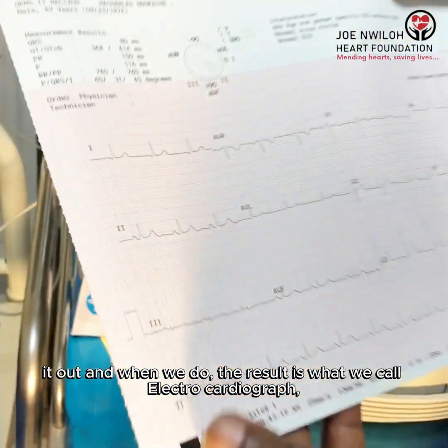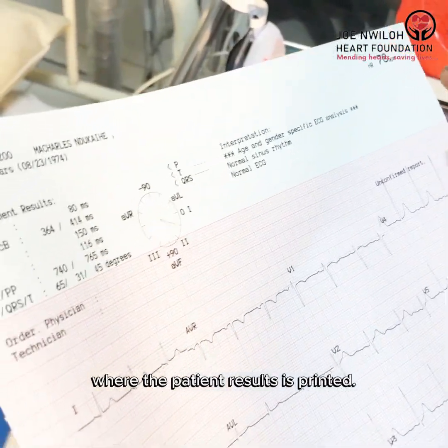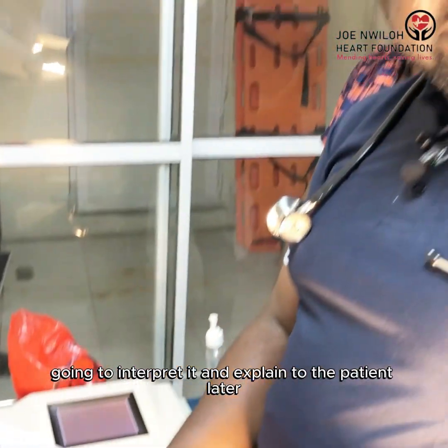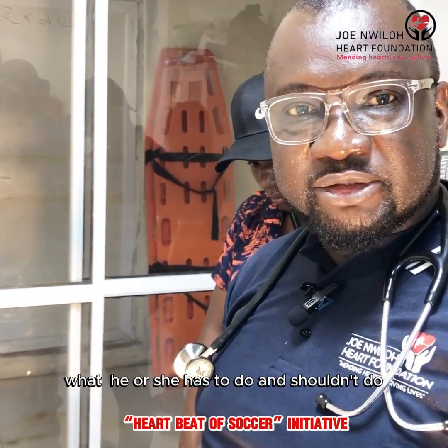So this is the electrocardiograph where the patient's result is printed. So on this result, we're still going to interpret it and explain to the patient later what he or she has to do and shouldn't do.